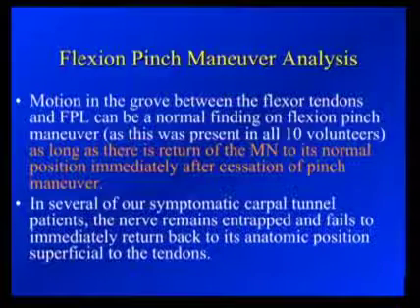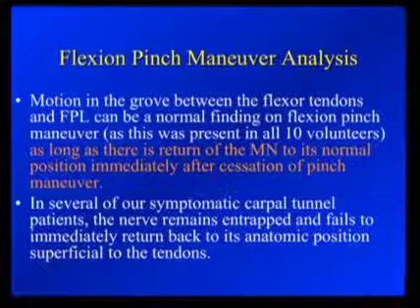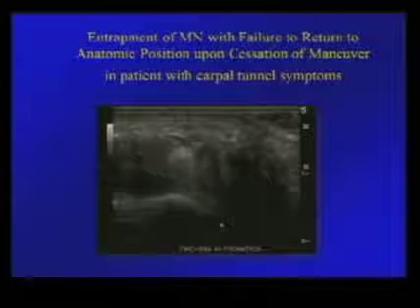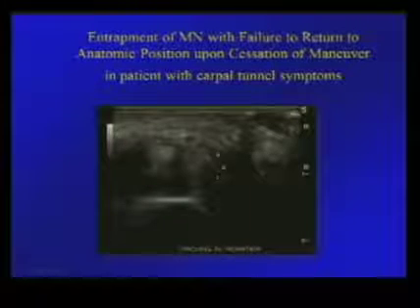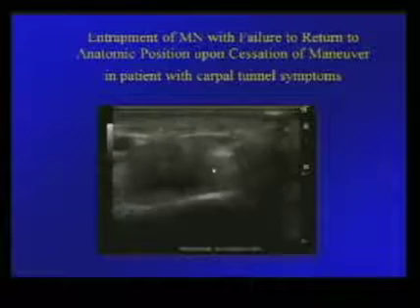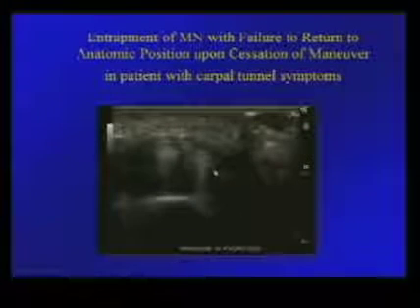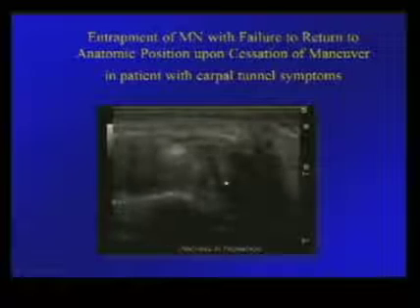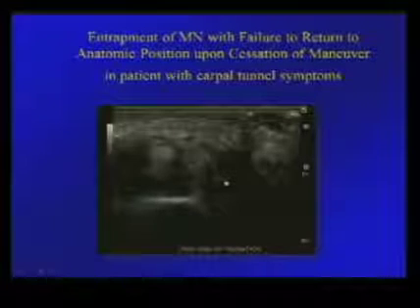In several of our symptomatic patients with carpal tunnel disease, we have noticed that the median nerve entraps within the carpal tunnel — in between the tendons of the flexor pollicis longus and the flexor digitorum — and does not spontaneously reduce to its anatomic position. With pinching, pronation, and wrist flexion, the nerve becomes entrapped, with an actual indentation from the flexor digitorum tendons upon the median nerve and no return to normal, causing carpal tunnel symptoms. This was seen in a very symptomatic patient — a sonographer who developed carpal tunnel disease after years of musculoskeletal sonography.